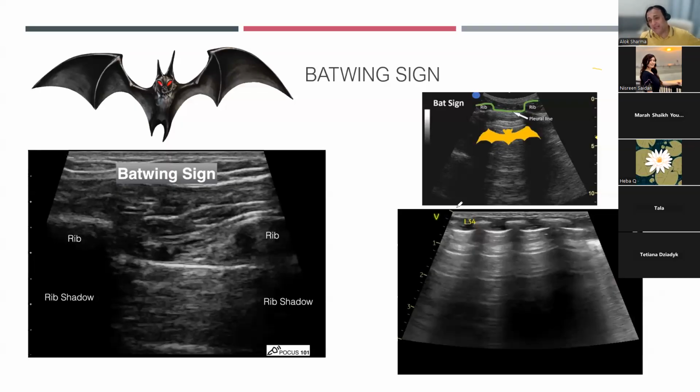If you have air in the stomach, again, what I'm saying to you is that sound waves interacting with the stomach are going from soft tissue to air. There's going to be reflectivity and there's going to be reverberation of the stomach wall. So you might actually get a structure on the left that looks like the lung. Now, if that looks like the lung and there's no sliding, you might think there's a pneumothorax and you might end up puncturing lung, and you don't want to do that. So puncturing stomach as opposed to lung.